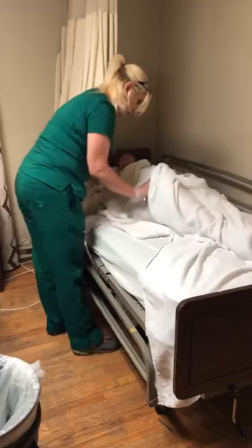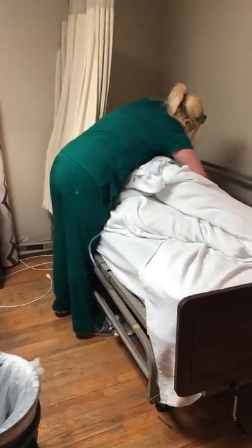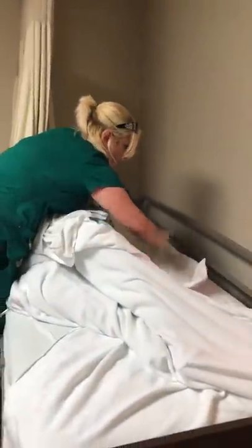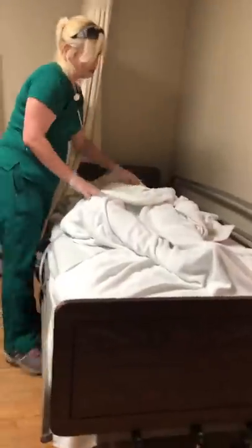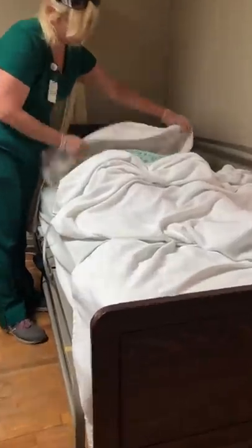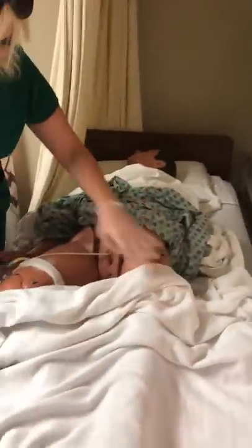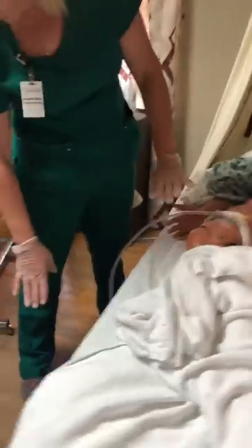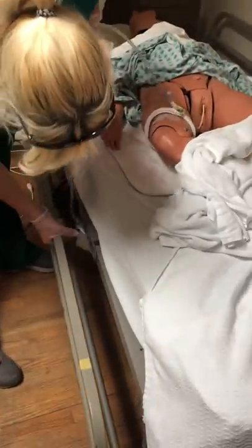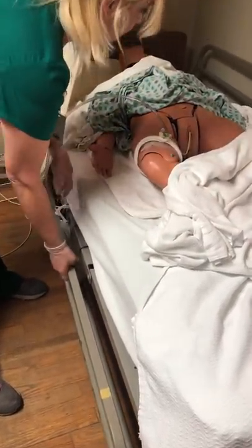Tuck that underneath them, then roll them back towards me. Roll that out from under them so that we're not causing any friction. Now we can expose the area we're going to be tending to — their perineal area. I'm going to visualize this catheter tubing and confirm that it is free of kinks and that the urine is flowing freely.